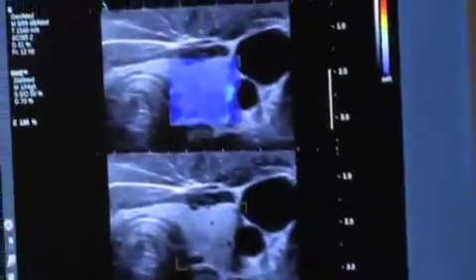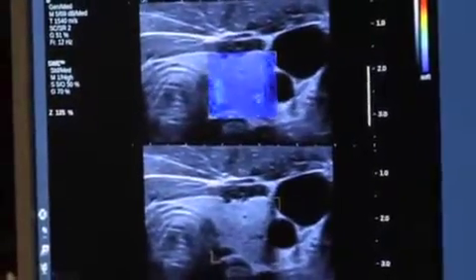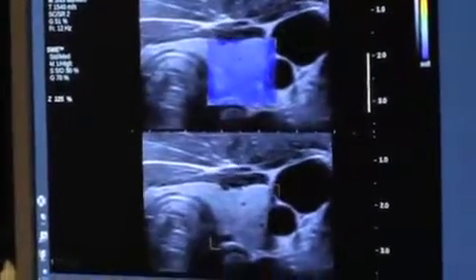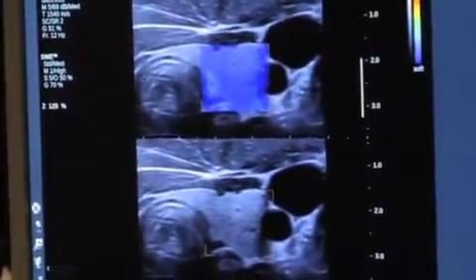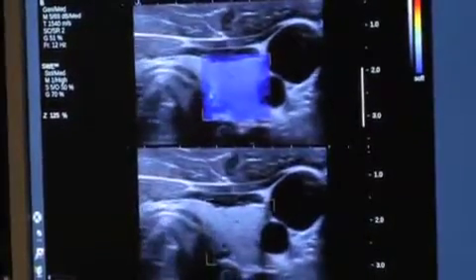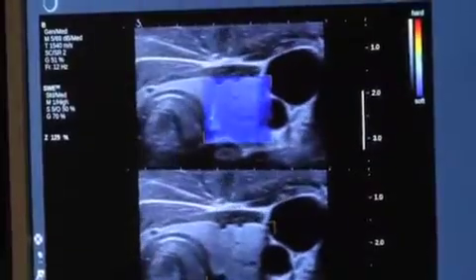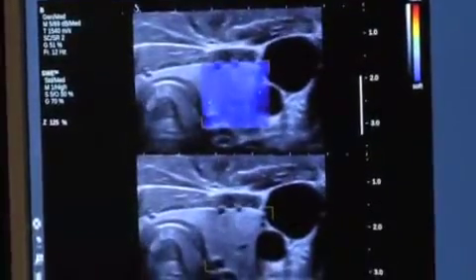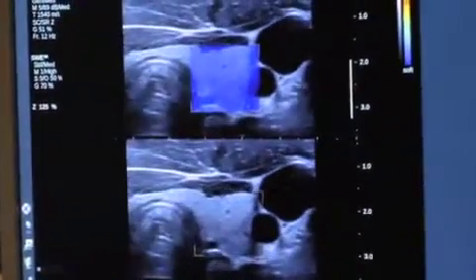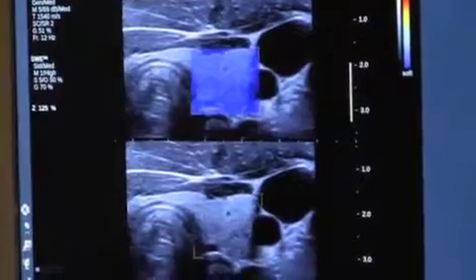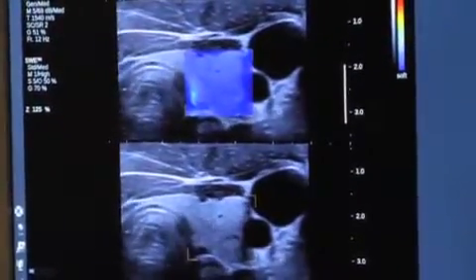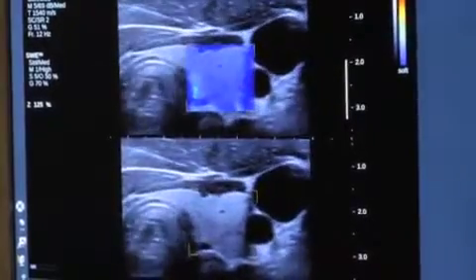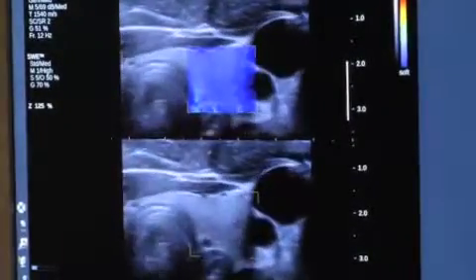I can make this window larger or smaller depending on the area of interrogation that I would like to see. As you can see, I am scanning in real time. I can move the transducer and I have my shear wave or stiffness information. I do not need to compress — shear wave elastography does not need any compression.